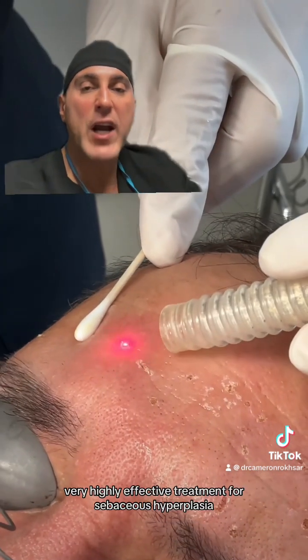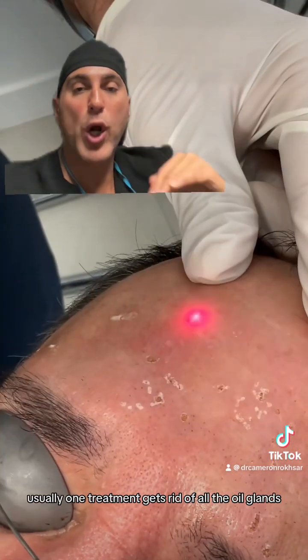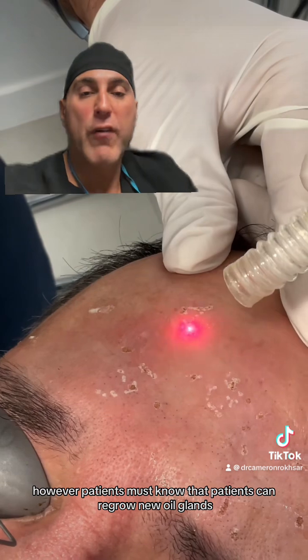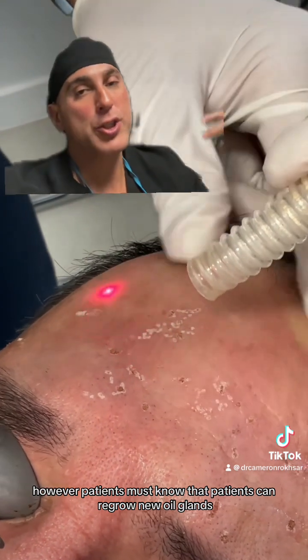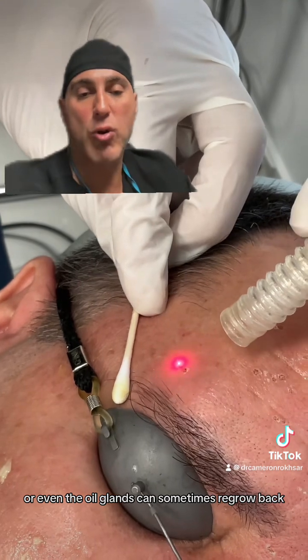This is a very highly effective treatment for sebaceous hyperplasia. Usually one treatment gets rid of all the oil glands. However, patients must know that they can regrow new oil glands, or even the existing oil glands can sometimes regrow back.